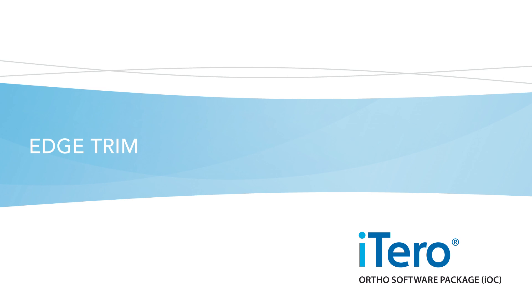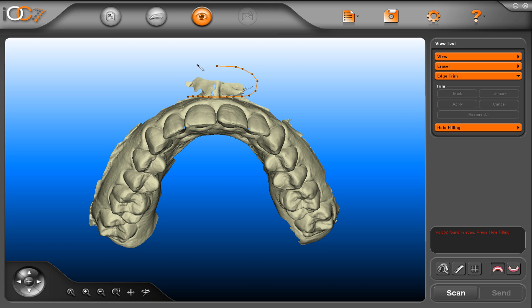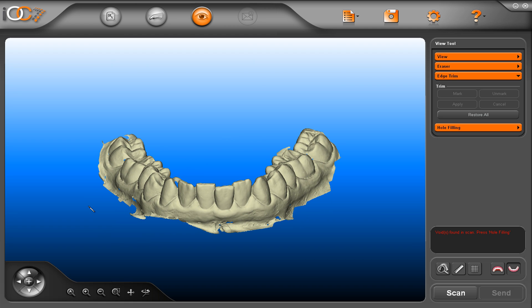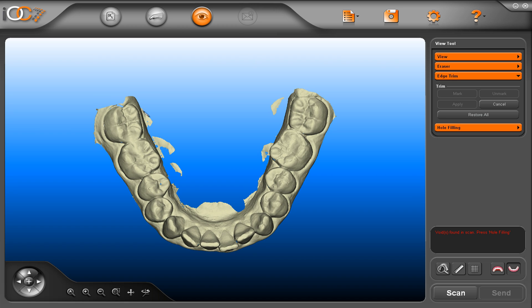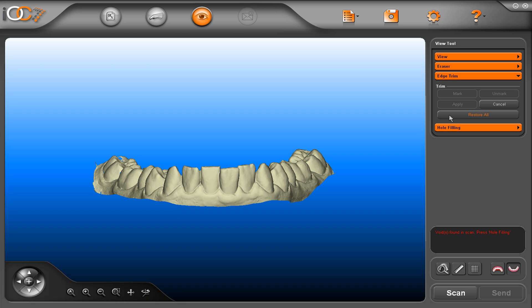Edge trim. Another useful feature is edge trim, which enables you to clean up the edges of your model. In this tool, you can view one jaw at a time. The edge trim tool allows you to mark a particular area you wish to remove from the model — usually soft tissues or other artifacts. Press mark, press apply, and the soft tissue will be removed from the model. If you remove something accidentally, press restore all to bring all surfaces back.